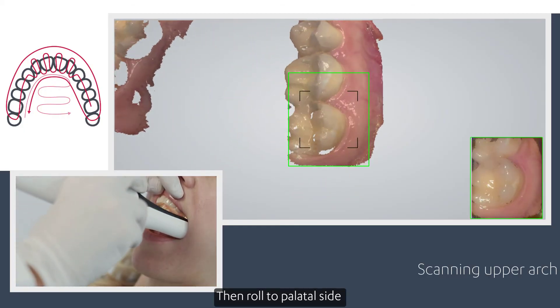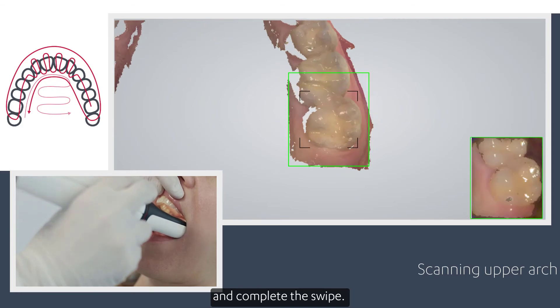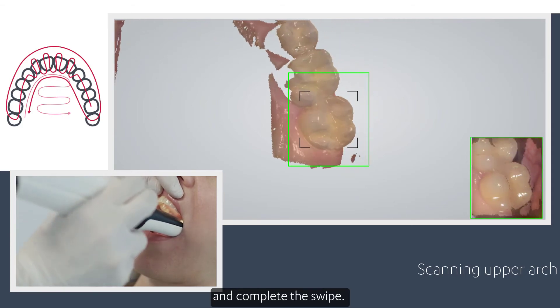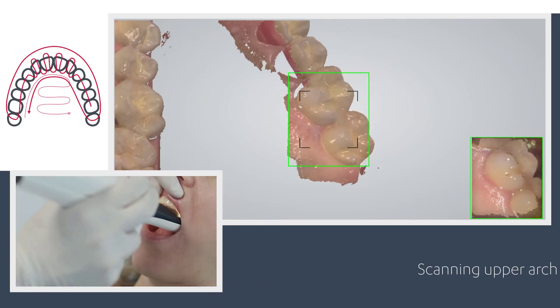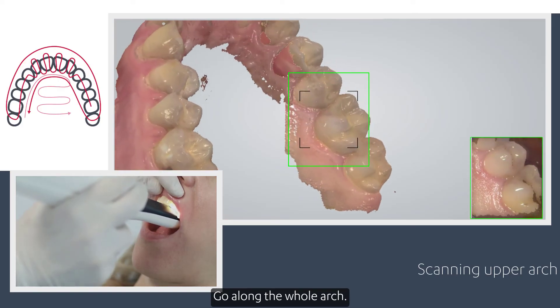Then roll to the palatal side and complete the swipe. Go along the whole arch.